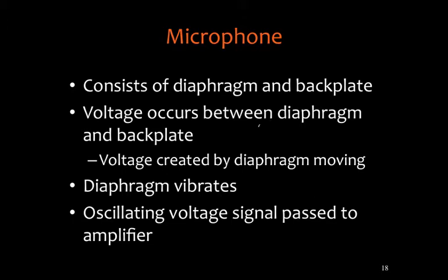So just a couple more quick points about the microphone aspect of a hearing aid. When we consider a microphone, it has a diaphragm, a membrane, not that much different in principle than the tympanic membrane, because these are sort of analogous structures, something that converts sound waves into something else. Now, the tympanic membrane, that structure at the medial end of your ear canals, is designed to move, to vibrate when sound waves hit it. And that vibration, that movement is actually converted into the mechanical energy of the movement of the attached ossicles.